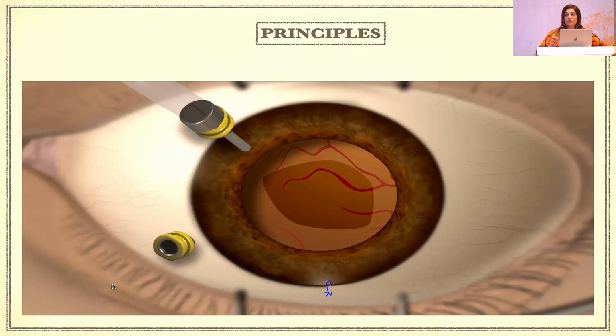Now, what I have seen practically is that most anterior segment surgeons have an inhibition about putting a trocar cannula into the system at about 3 to 3.5 millimeters from the limbus. Believe me, it is one of the most simple things that you can do, provided you follow the method of how to do that. And maybe any of your VR friends can help you with that. So that's one thing which can be very handy.